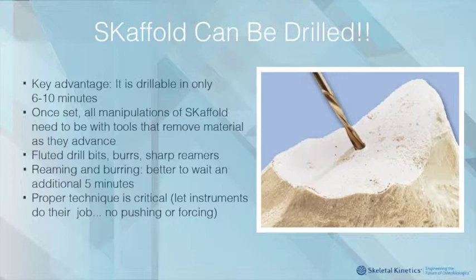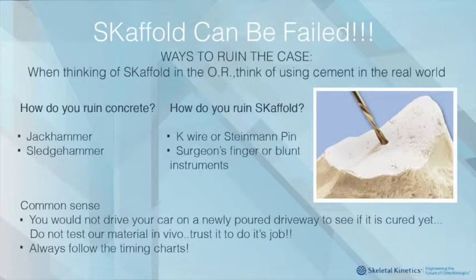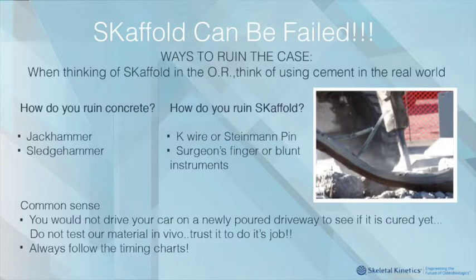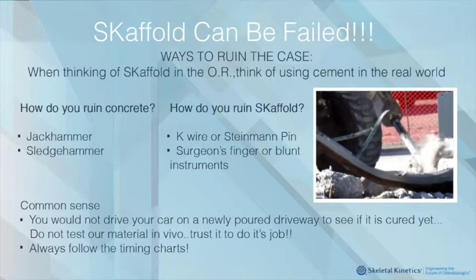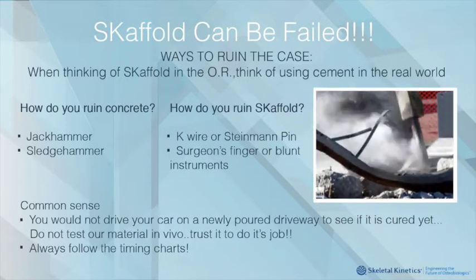Let instruments do their job, no pushing or forcing. While SKaffold can be drilled, SKaffold can be failed. Like any hard-setting dynamic product, it can be failed if not used correctly. SKaffold is not much different mechanically than concrete that would be poured in the real world. So use common sense. To break up concrete, people use jackhammers. A jackhammer is equivalent to a K-wire or Steinmann pin in the operating room.